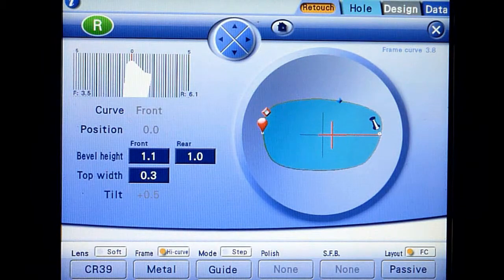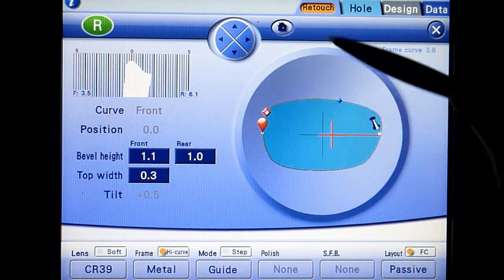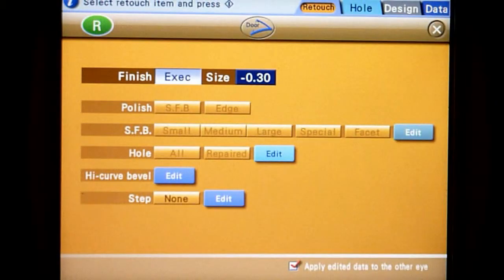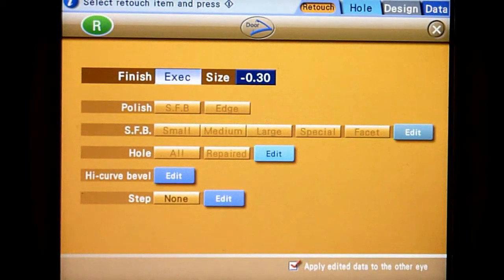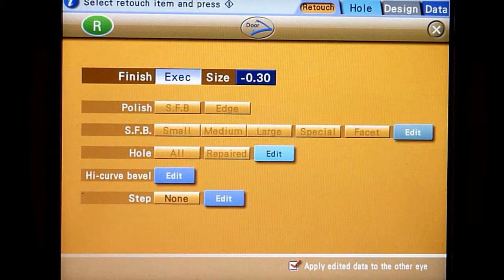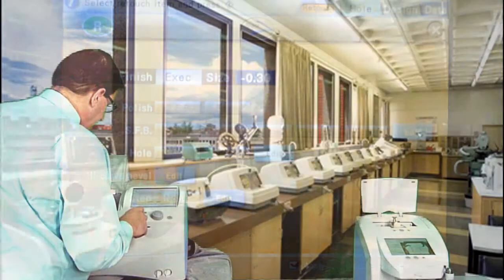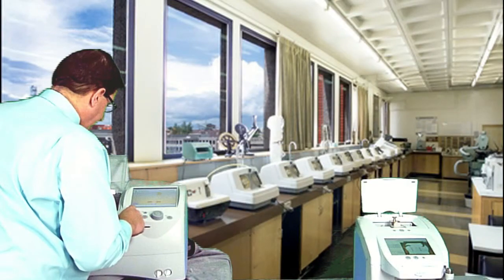Touch the retouch tab to exit the bevel simulation screen. Press start to complete the retouch process.